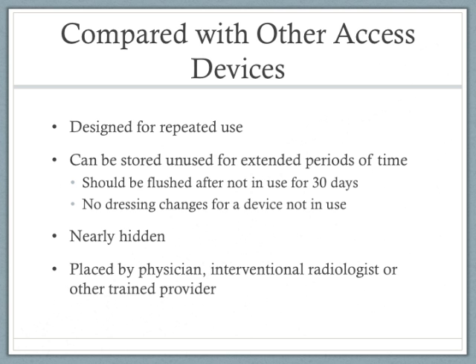When comparing a port with other devices, the port is designed for repeated use over a long period of time. It is also designed to be stored unused for extended periods of time as well. The port should be flushed at least every 30 days when not in use. But you also don't have to worry about dressing changes like central lines because there is no dressing to change since it is subcutaneous. It's nearly hidden and it is placed by a physician, an interventional radiologist, or other trained healthcare provider.